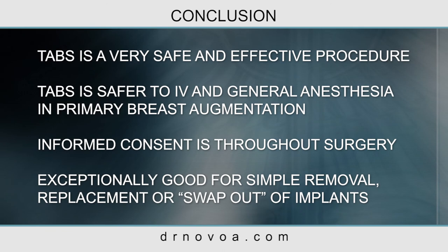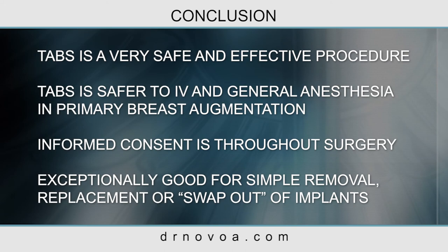In conclusion, TABS is a very safe and effective procedure. It is safer as compared to IV and general anesthesia. Informed consent is maintained throughout the surgery, and it is exceptionally good for simple removal, replacement, or swap out of implants.